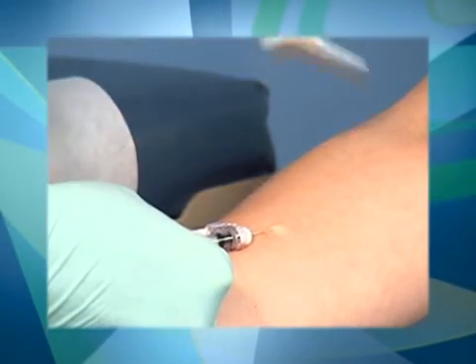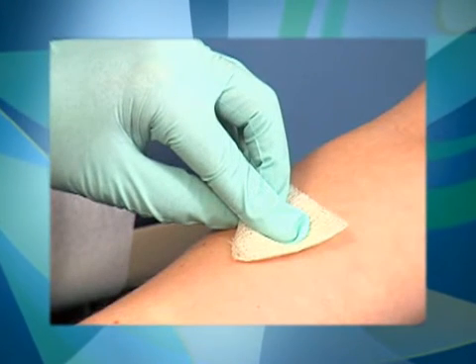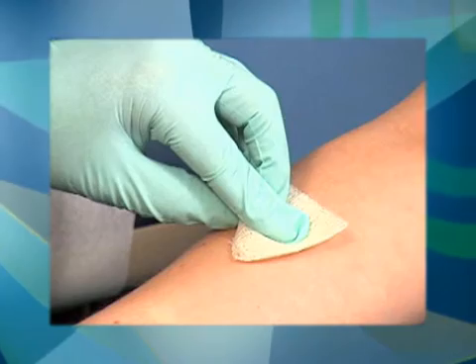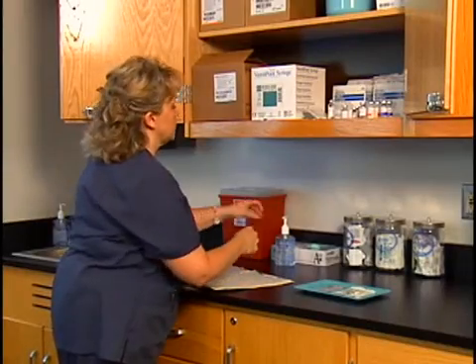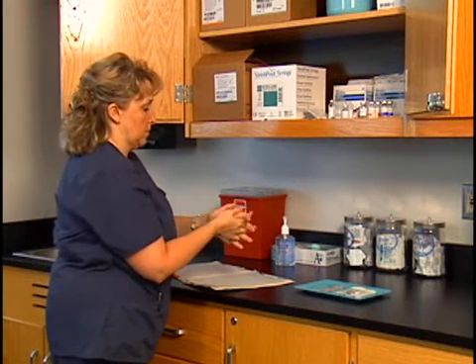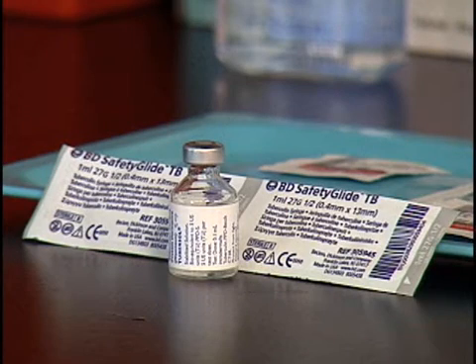The physician has asked the medical assistant to administer a Mantoux tuberculin test to a patient as part of an employment physical examination. To prepare the injection for a Mantoux tuberculin test, first sanitize your hands and assemble your supplies. You will need the Mantoux PPD tuberculin solution, a tuberculin syringe with a short needle, and an antiseptic wipe.